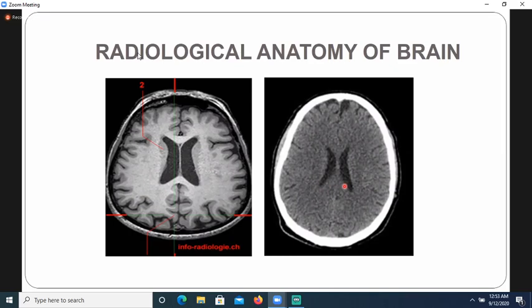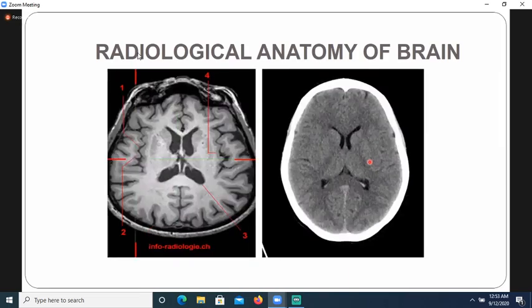Anteriorly, the frontal, this is the parietal lobe. Then lower down again, anteriorly frontal lobe, this is the parietal lobe, this is the occipital lobe. Here it comes. When these triangular structures come, this is the trigone. We see behind that the occipital lobe. Genu of corpus callosum, body, rostrum of corpus callosum, and these white structures.